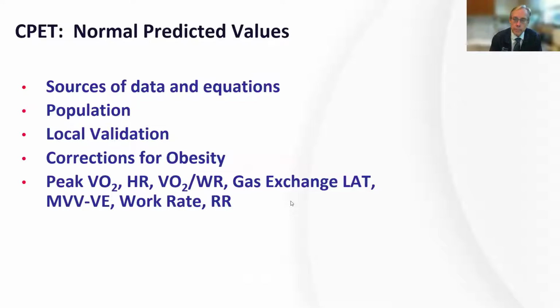Okay, so one of the things you're going to have to deal with is what kind of normal values you should actually use. And there really isn't a great answer for this in my mind, and I'm speaking for myself, but you have to pick a normal values to get comparisons.